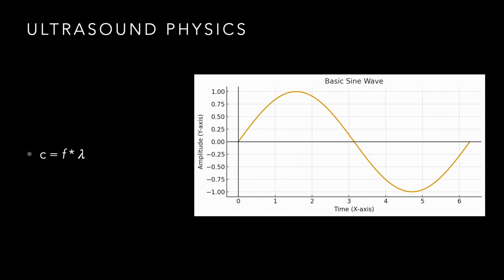So remember, the basic idea of ultrasound is it's reflected waves of sound, right? So the machine sends sound waves into the body. Those sound waves are influenced by the tissues that it goes through, right? It's either attenuated, it's reflected, various different things, and it returns back. There's the echo that comes back, and that echo is then picked up by the machine and it's displayed, right? And we'll show some images in that in just a sec.